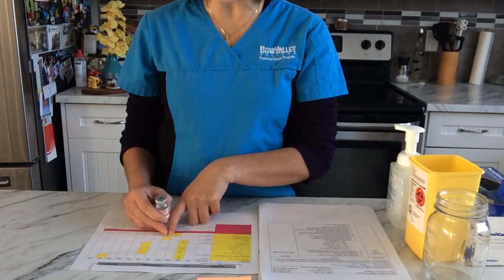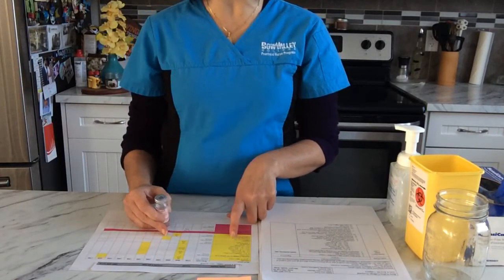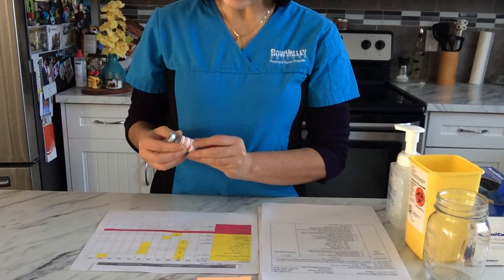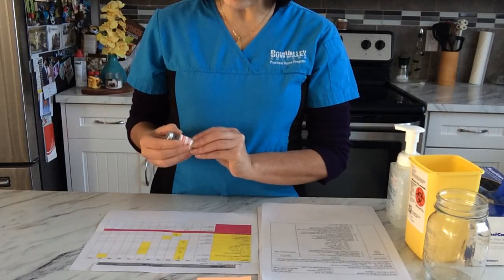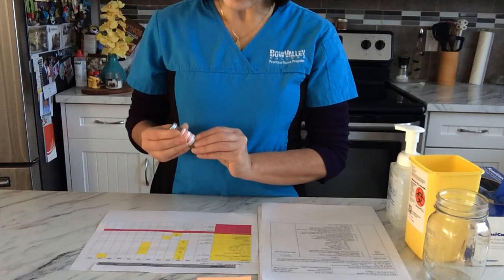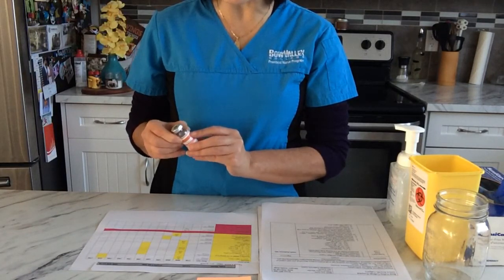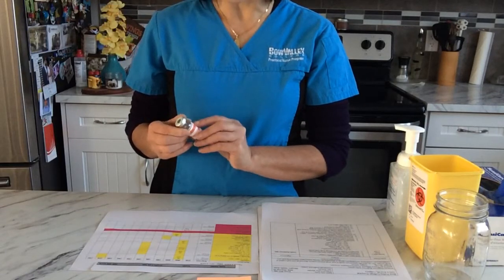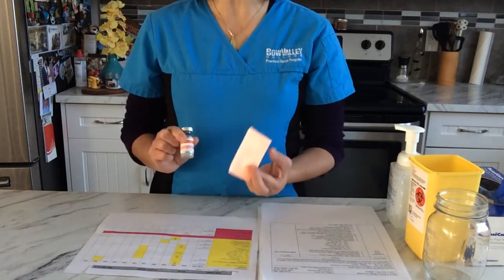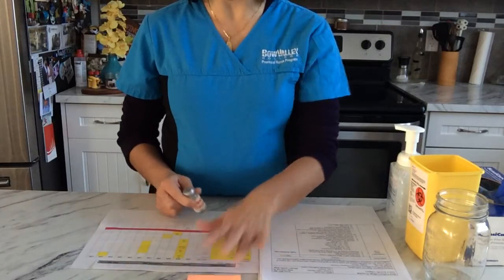It is 10 o'clock and we have to administer heparin 5000 units subcutaneous BID. I have in my vial heparin sodium. It is a multi-dose vial. It's 10,000 units per 1 ml. This is for subcutaneous and IV use, and the expiry date is April 2025. We did the math already, so we know that we have to withdraw 0.5 ml from this vial.